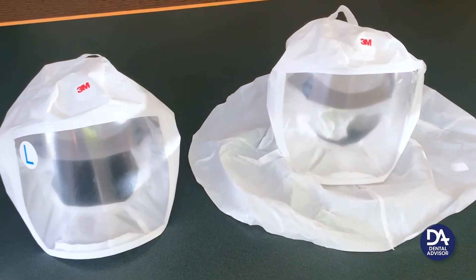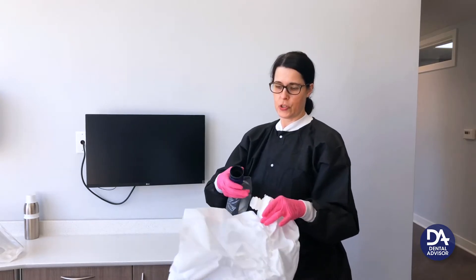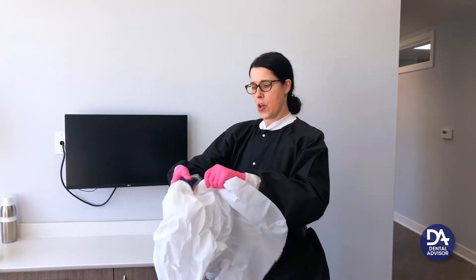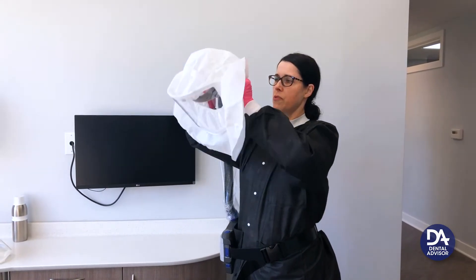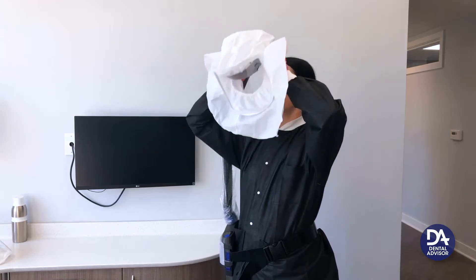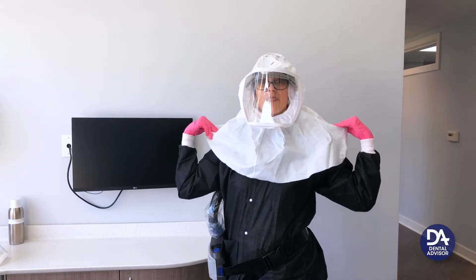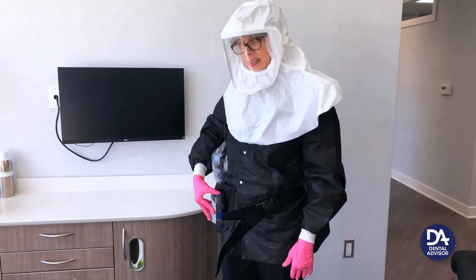Now I'm going to put on the shrouded hood. The same way, you're just going to squeeze the blue plastic piece and put it on there and tighten it up. For this one, it's a little bit easier if you place it straight over the top of your head and then put it under your chin, and turn it on.